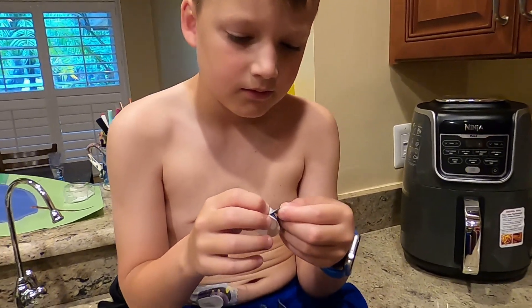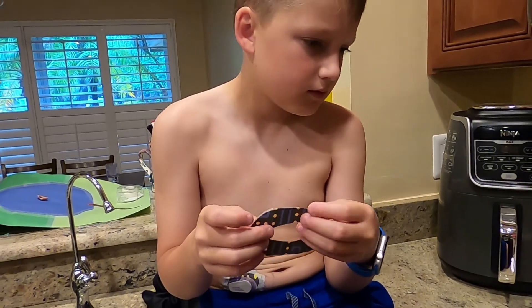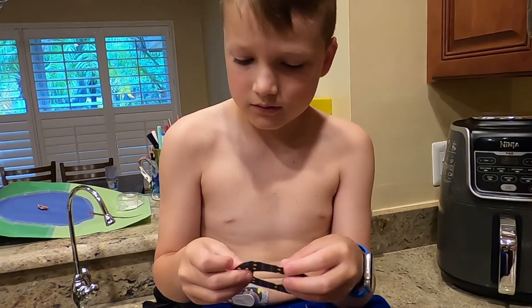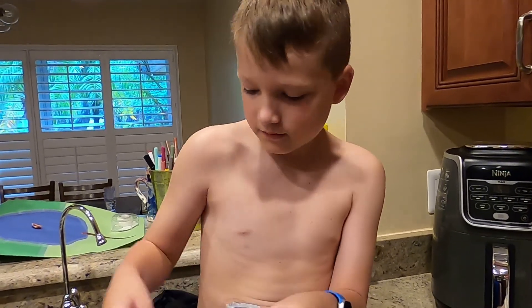Hey Porter. This is Abel and he just wanted to show you how he puts on his Dexcom G6. We're so excited that you are getting yours. We have lots of background noise, sorry. But we just want to walk you through how Abel does it.